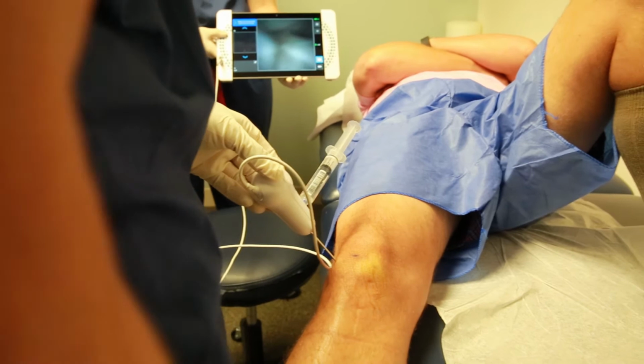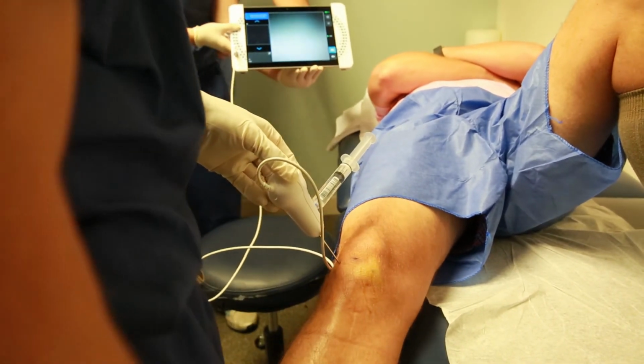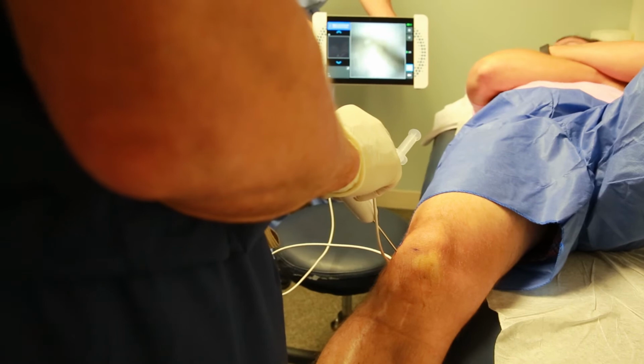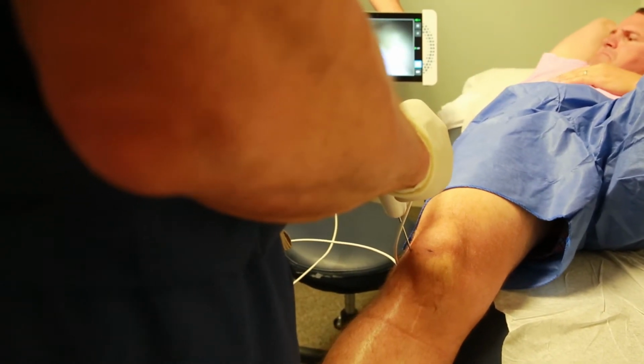If your assistant sometimes puts a little bit of force on, it could be helpful. We're going to go to his lateral compartment, and to do this, what I can do is just take his leg and push down a little bit. So we're good. There's his ACL. You'll see it right there. Nice picture of his ACL. It looks good. I can go over to the lateral side.